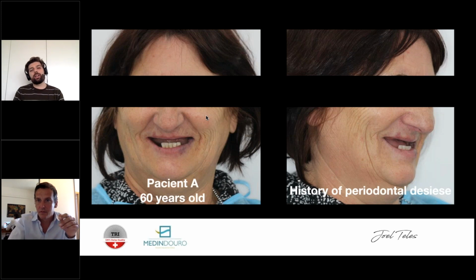Yeah, it depends on a lot of stuff. It's difficult for me to have an implant with only 20 Newton centimeters. With your implants, it's very tough to imagine that for me. Normally, I would always get higher than that. If I didn't, I would have some tips and tricks to gain torque.